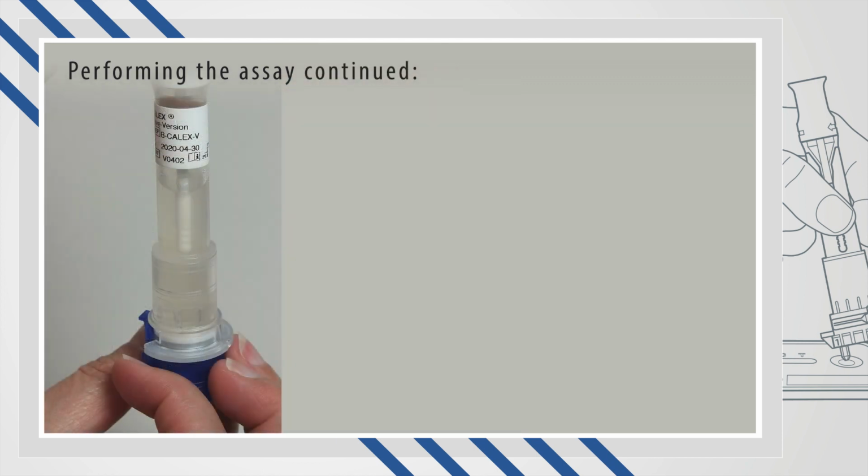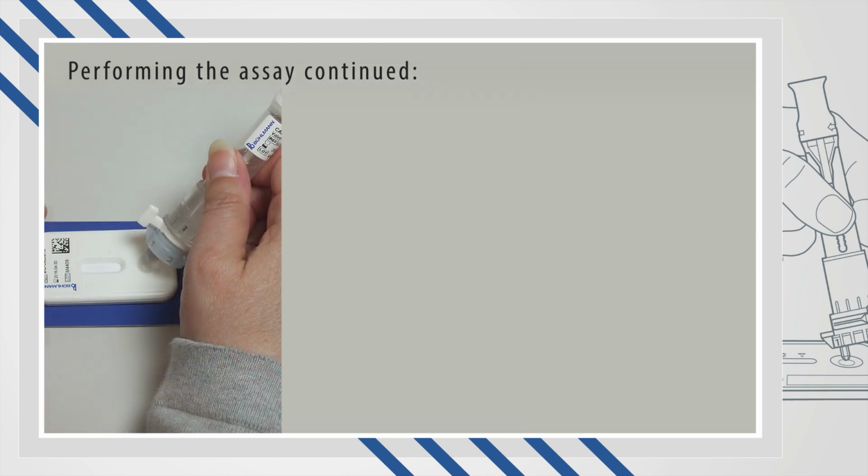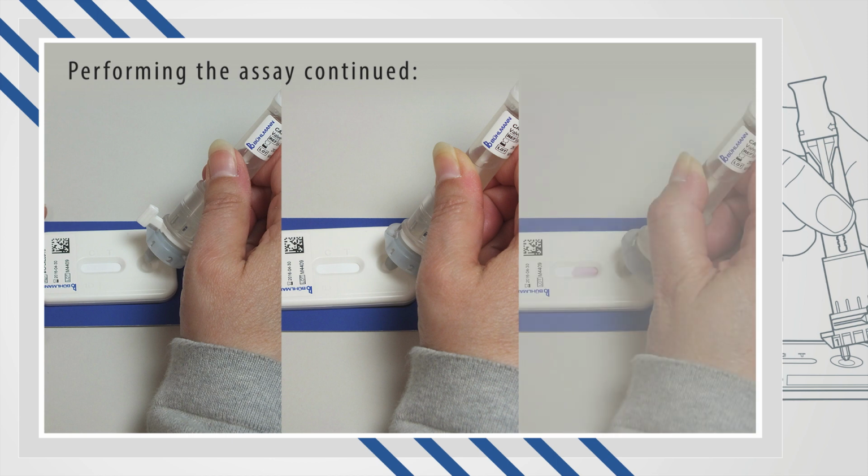Take the blue cap off the end of the CALEX valve. Put the end of the CALEX valve into the small circular hole at one end of the cassette and move the lever on the CALEX from position 1 to position 2. A small but defined amount of solution will be released from the CALEX valve. It is best to hold the CALEX valve at a slight angle, as this aids the release of the liquid.